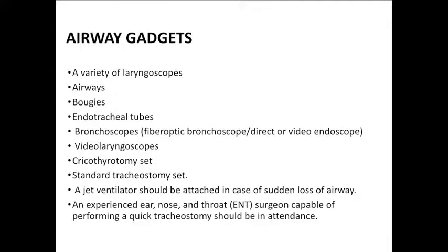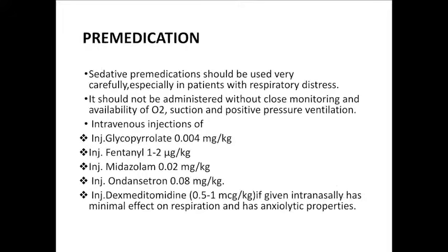The most important factor is to predict the ease of ventilation with face mask and the ease of intubation with direct laryngoscopy. In any case, if the airway is compromised prior to induction, it is better to secure the airway. Various airway gadgets are also needed before going to the procedure, and this is the list of gadgets which should be kept ready along with the difficult airway cart.